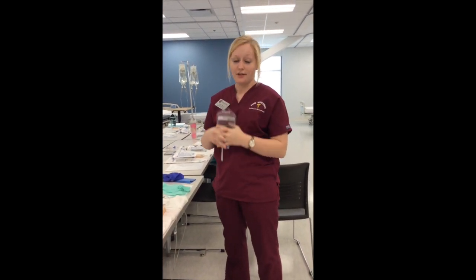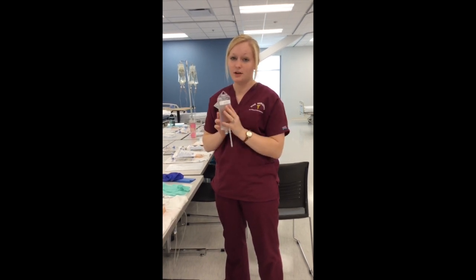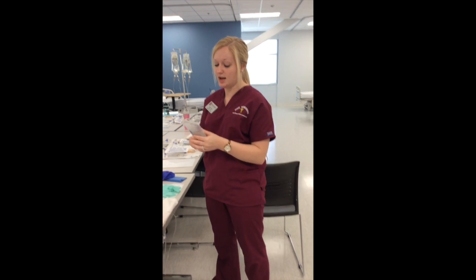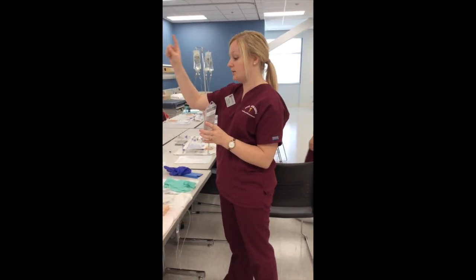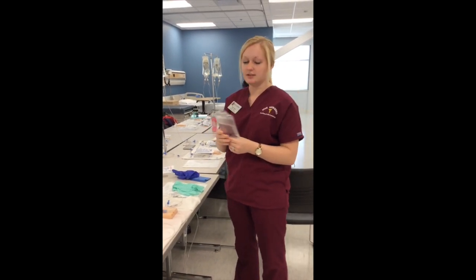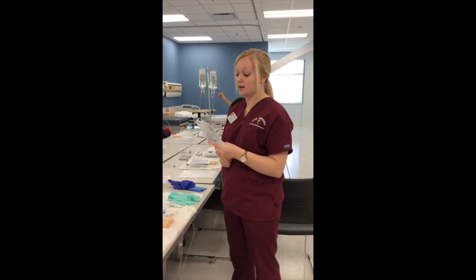Thank you. Do you have any allergies that I need to be aware of? And if they tell me, hopefully they're not allergic to fluoroquinolones or levofloxacin or anything, so that would be good. And I'm going to tell them that I'm here to give them levofloxacin, that it's an antibiotic, and it's an IV piggyback, so it's going to hook up to the IV they already have. It's going to infuse over about an hour, so they can expect to have that infusing over the hour.